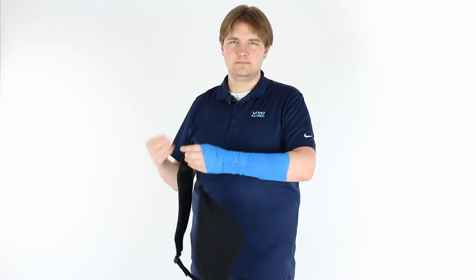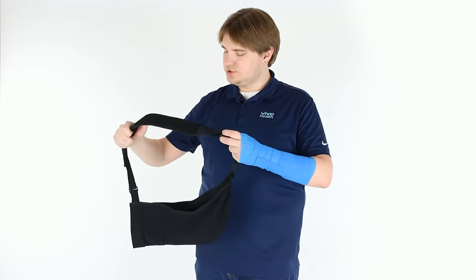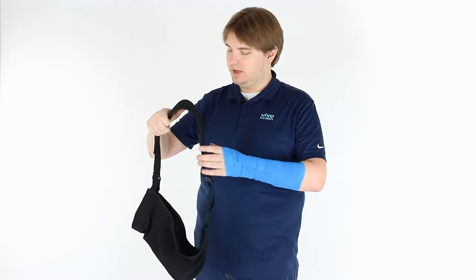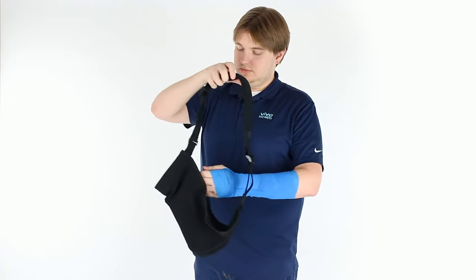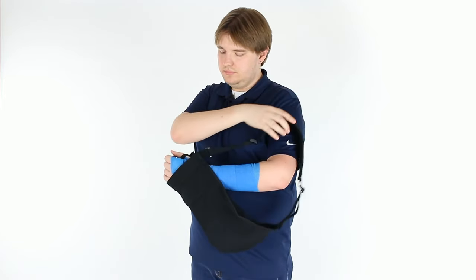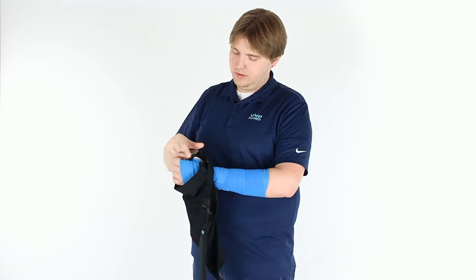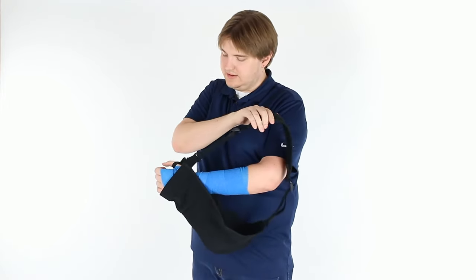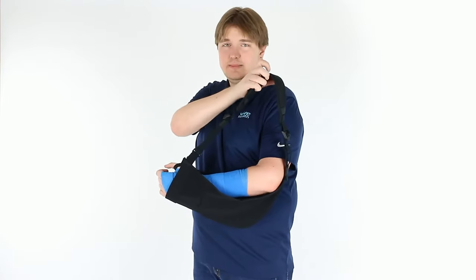For demonstration purposes, I have my arm wrapped up here so that we can show how to fit the arm sling properly with limited arm mobility. You'll start by fitting your arm through the opening here and hooking your thumb on one of the two elastic straps. There's one on either side of the sling, so it can be used ambidextrally.